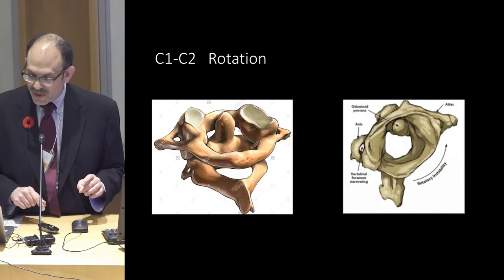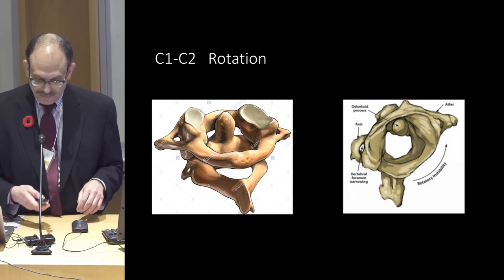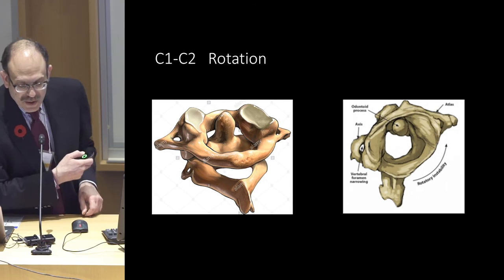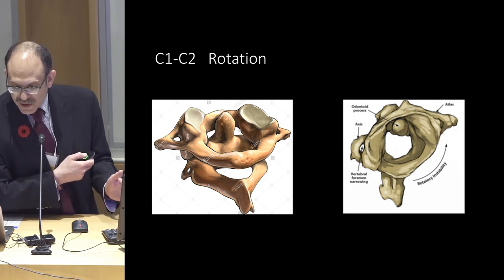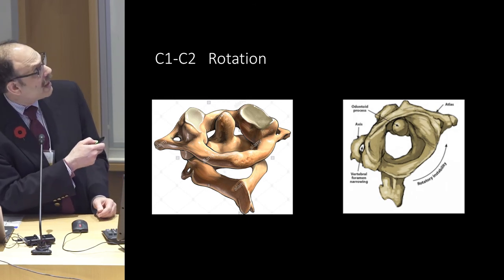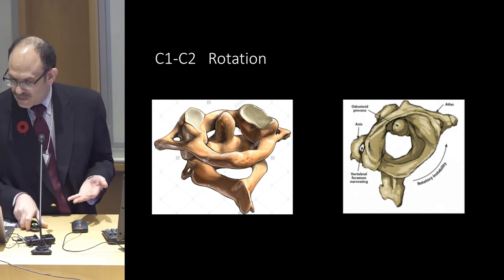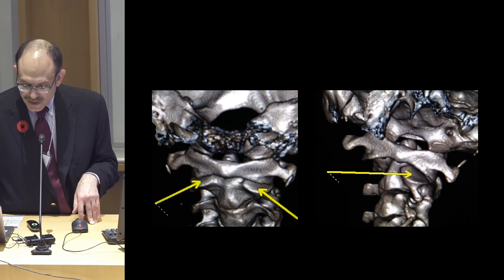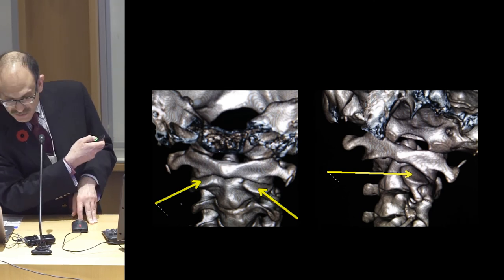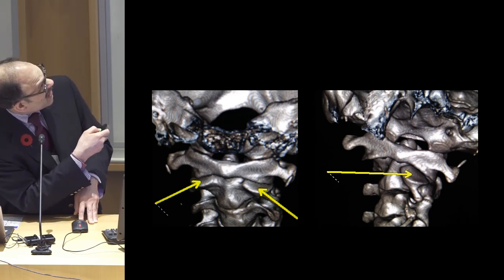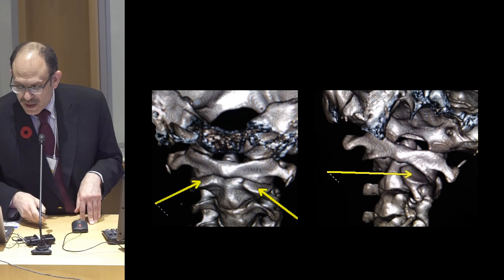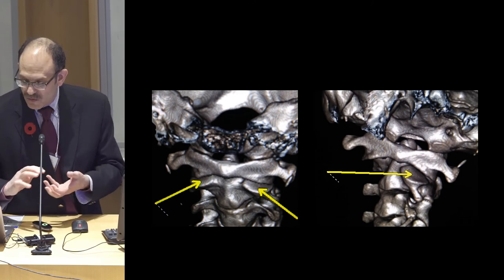This is a representation of pretty much normal rotation — normal position facing forward and then rotation. And here is facing forward versus turned, showing the facets: the joint between C1 and C2 is opening up when turned.